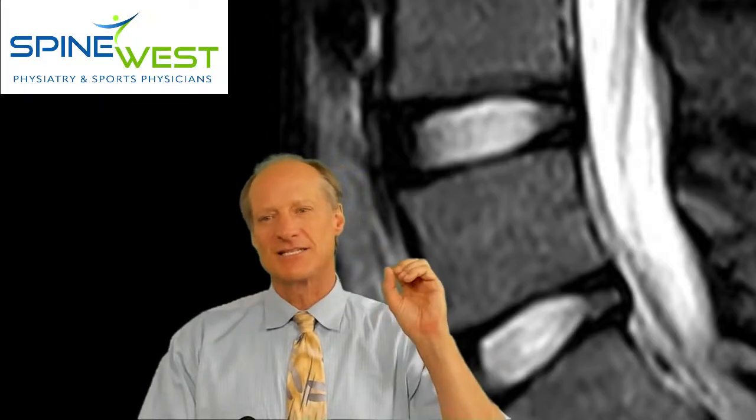You don't see the MRI quality imaging of the nerves, etc. If you look at the MRIs, however, you can see that there are very fine nuances, that you can see the fluid within structures. You can see very fine soft tissue like nerves, etc. And so an MRI is a little bit more detailed for the soft stuff, and the CT scans and the X-rays are a little bit more focused for bony configuration or calcium deposits.